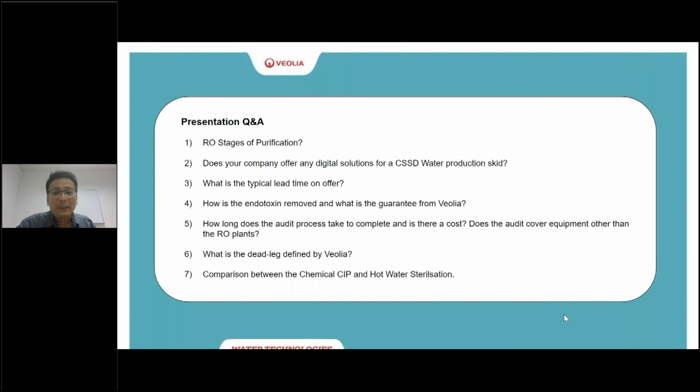For CIP, or cleaning in place, to me is towards intermittent sterilizations, which I also consider as occasionally hostile conditions that may allow biofilm formation between the sterilization processes. CIP, in fact, is easy to attack the naked cell, but it's more difficult to attack biofilm formation within the main ring itself. Ideally, it should be done often enough to avoid substantial biofilm growth within the system.